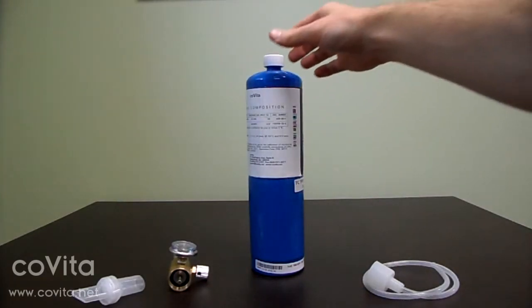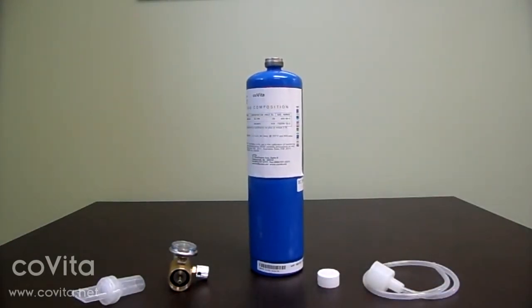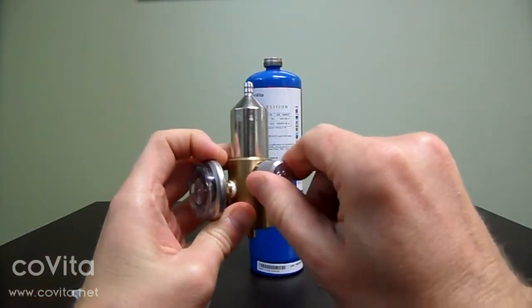First, remove the dust cap from the calibration can and set it aside. You will be replacing this when we're finished with calibration. Next, ensure the regulator valve is closed, and then connect the can to the regulator.